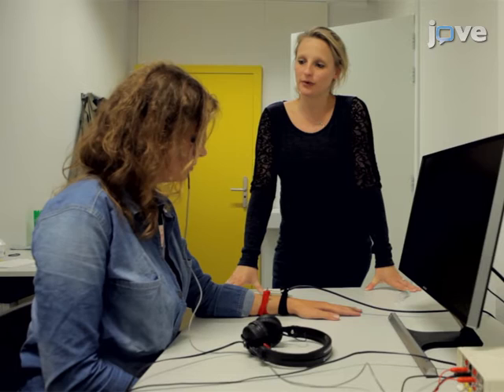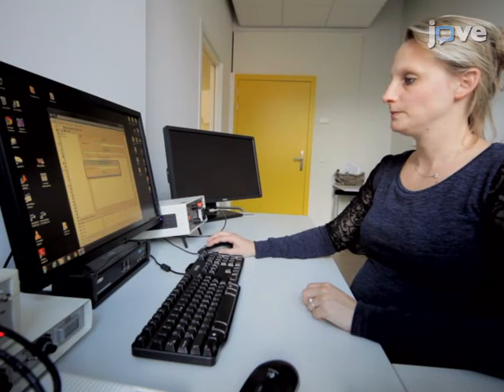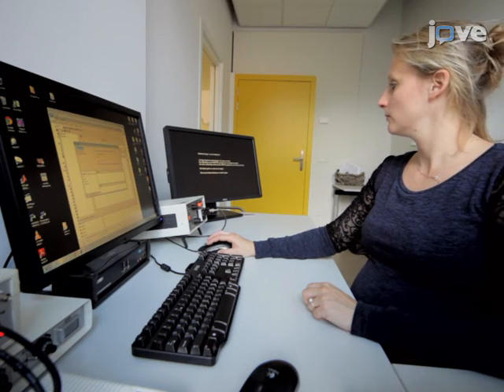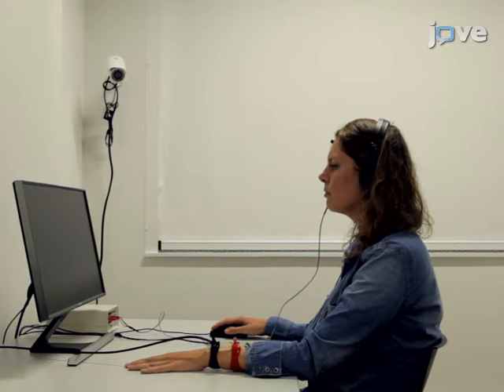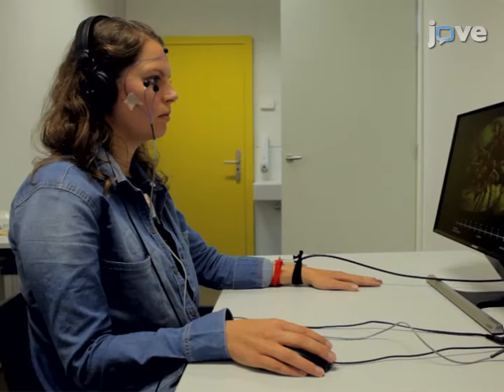Again, instruct the participants to report the expectancy of an electric shock. After dimming the lights and leaving the room, begin the memory reactivation by presenting 10 baseline startle probes to diminish initial startle reactivity. Next, present a single unreinforced CS1 trial followed by a single noise alone trial.